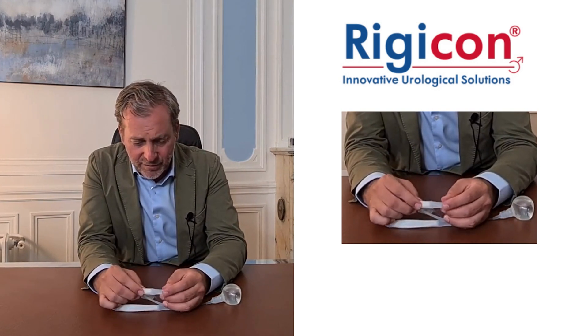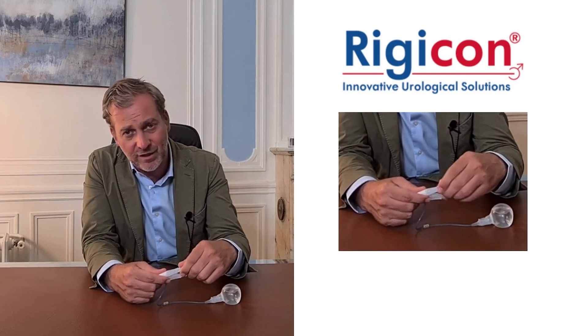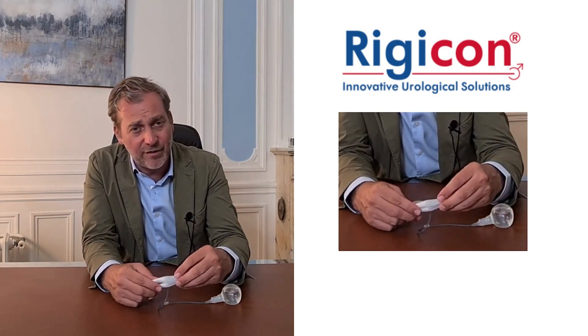Then you have this reinforcement here that we call the fourth layer. This fourth layer protects the device from erosion and quick erosion of the tubings. Then you have the Connect Secure rear tips. Your actual rear tip extender is locked to the cylinder, making it difficult or impossible to lose inside your patient if you have to go for revision surgery and have to remove the cylinders.